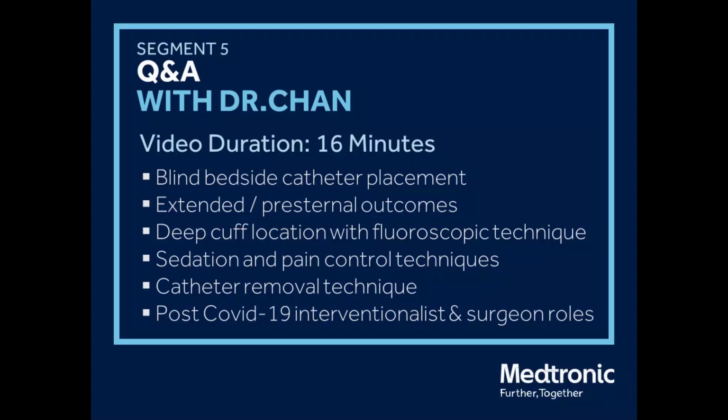The only difference is you have a connector, like a titanium connector, between the catheters to make it longer. And then the tunnel is actually longer as well. So that's really the only difference. When you get up to that area, you still need to make that exit site downward facing or lateral facing. You can't have it straight up, and that's contraindicated.